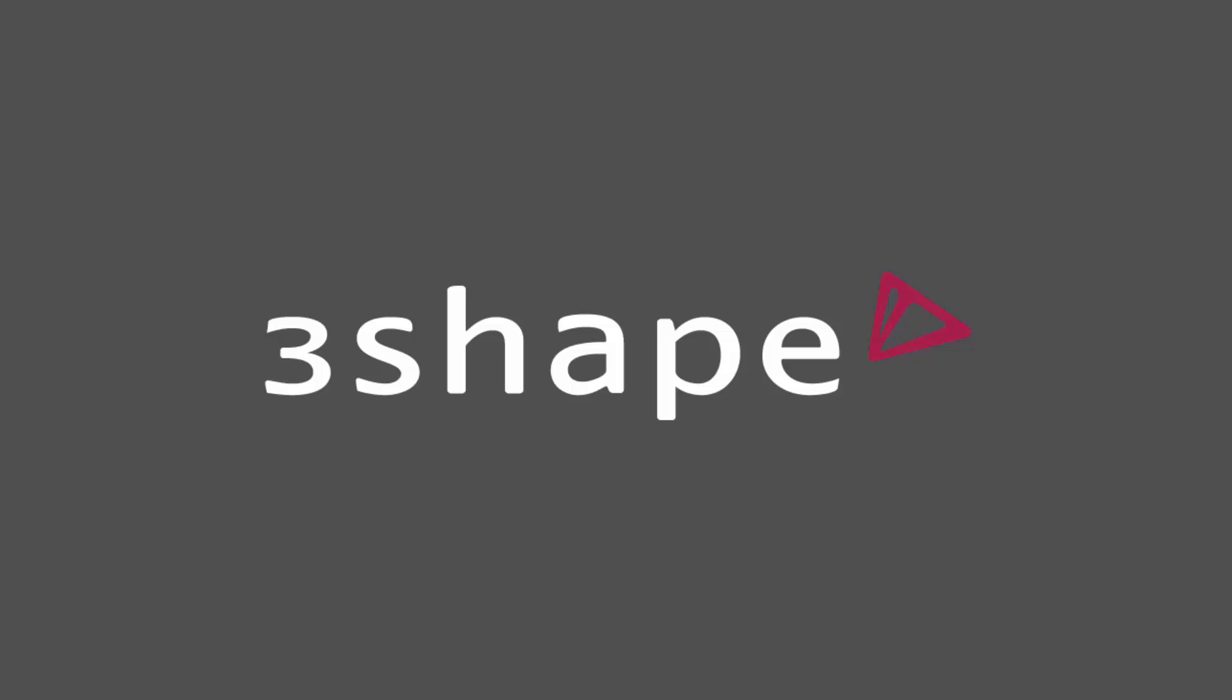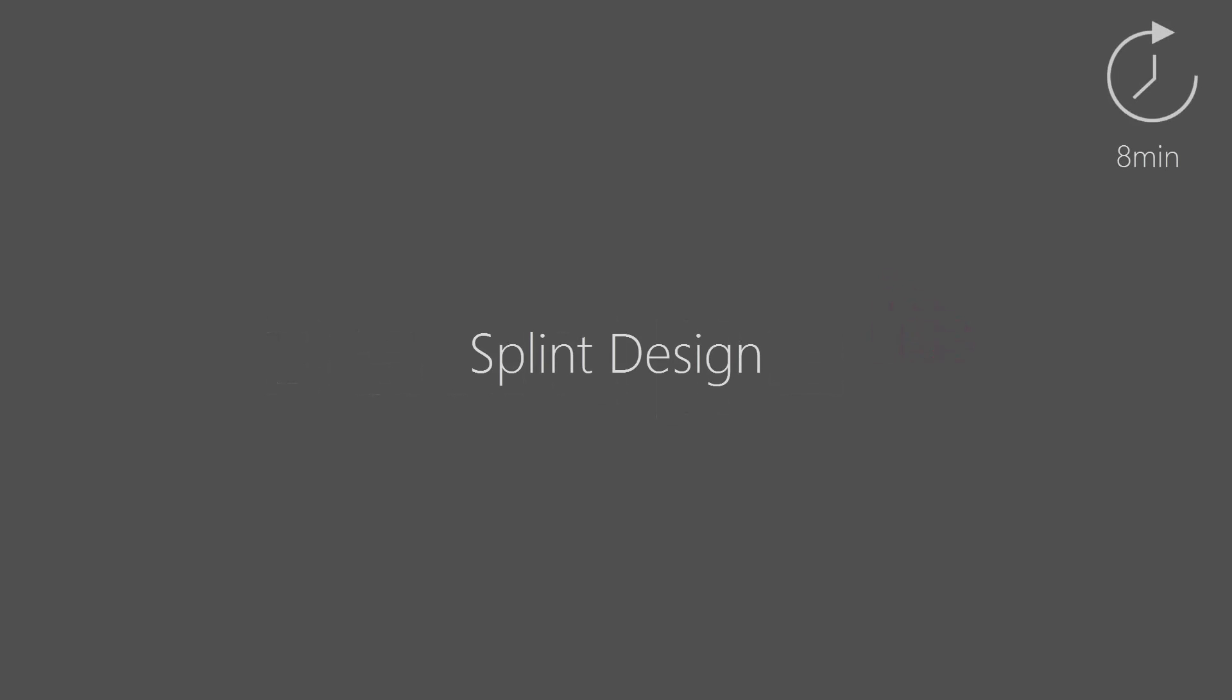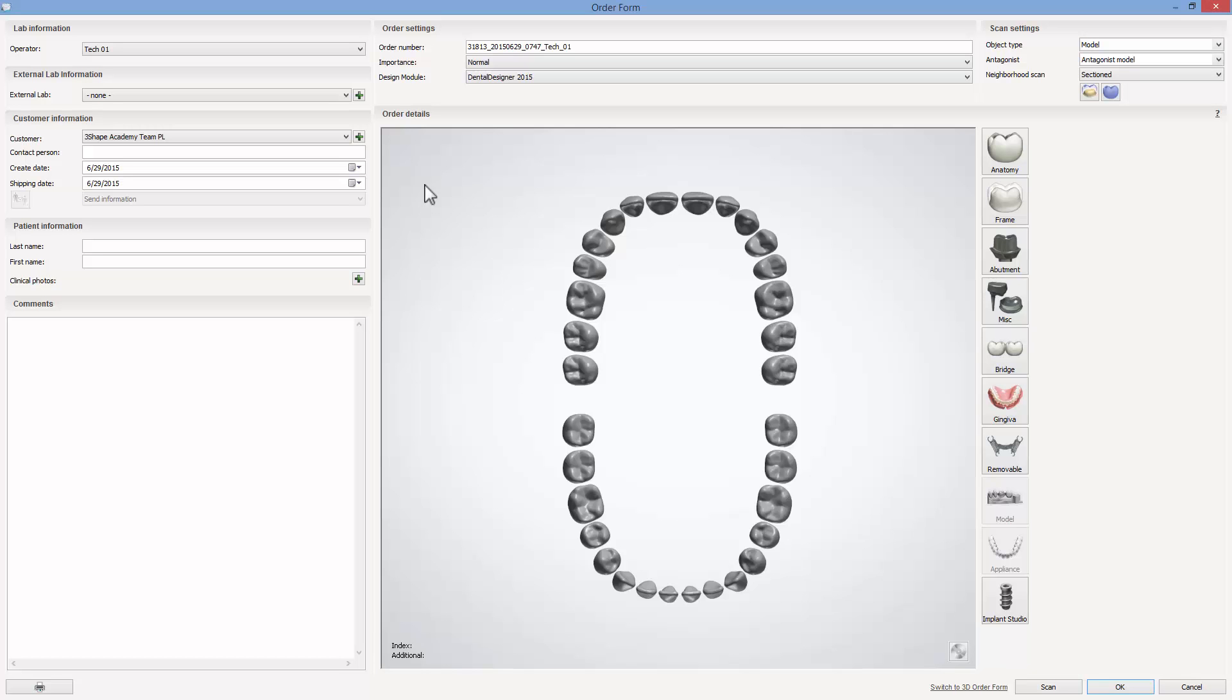In this video we are going to show you how to design a splint with bar using 3Shape dental system. This possibility has been now added to a wide range of available indications. For splints design, dental system will automatically move to appliance designer.